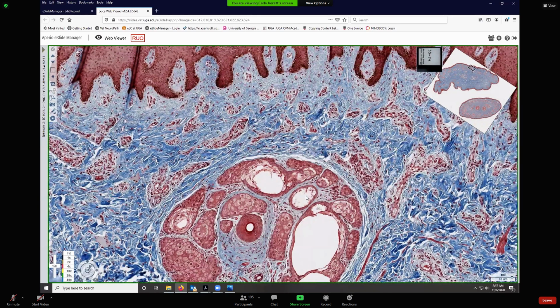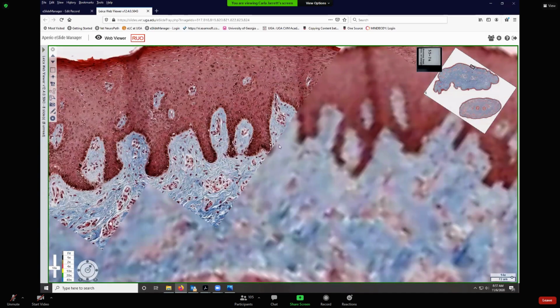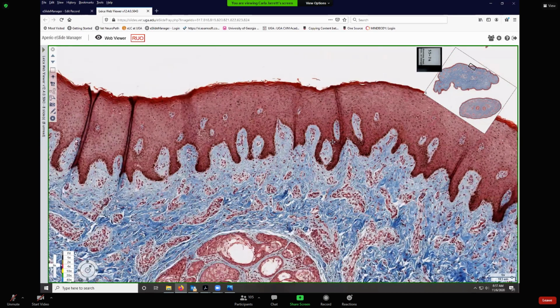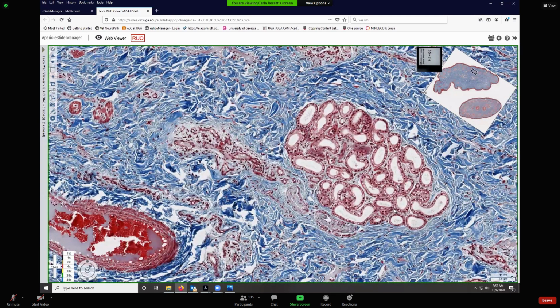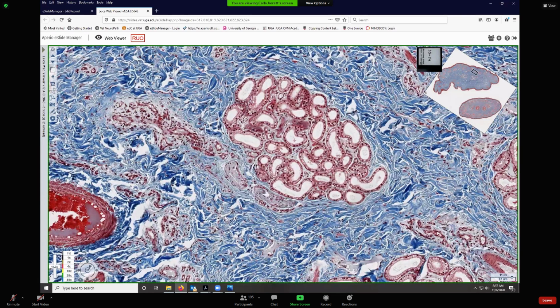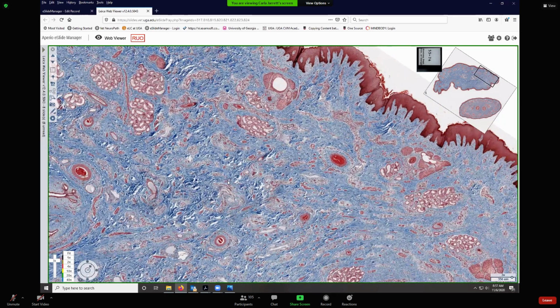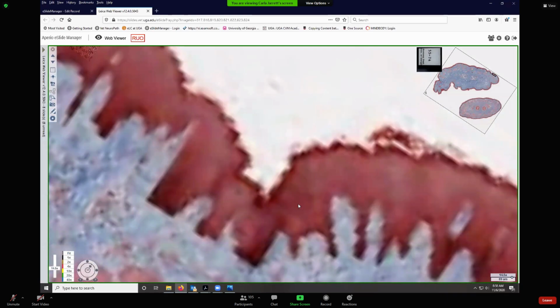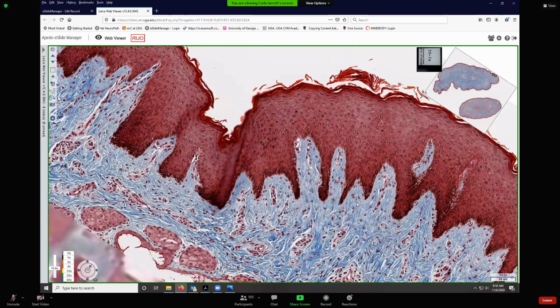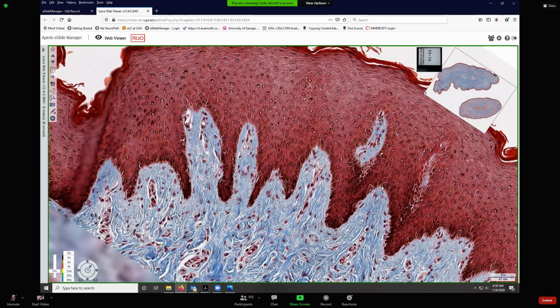You can practice your dermal papillae and your epidermal pegs, your papillary layer and your reticular layer. You can practice sebaceous gland ID. You can be amazed at these massive piles of sweat glands so that horse can do what it does. It sweats a lot. And you can practice all the layers, or as many layers as you can ID, in your stratified squamous epithelium. And this teat had heavily pigmented skin, so you can see a lot of melanin.